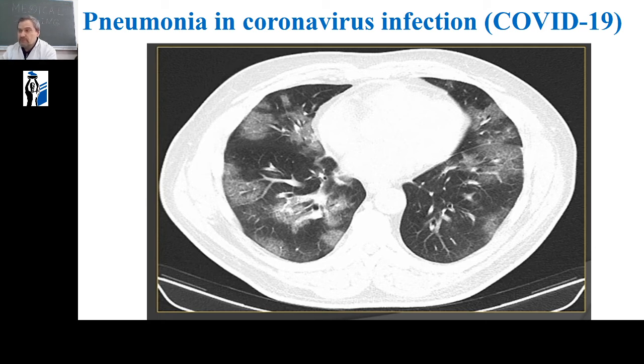This is the symptom of ground glass opacity, which consists in an increase in the density of lung tissue, but the alveoli also retain airiness. Bronchi shine through these areas of ground glass opacity.